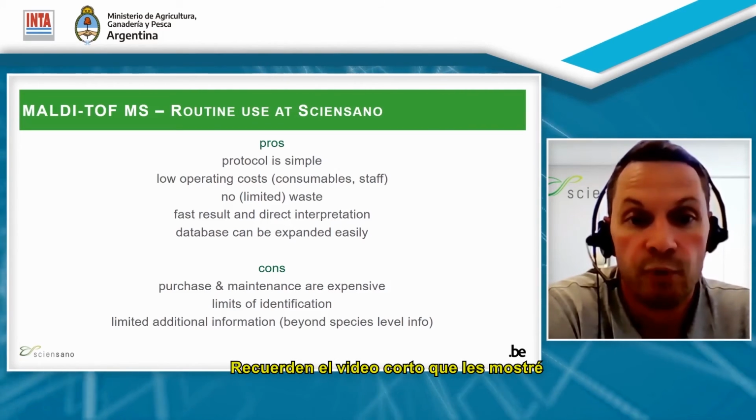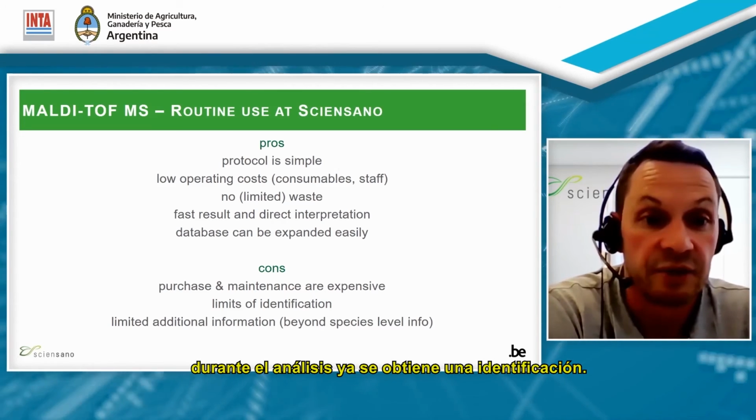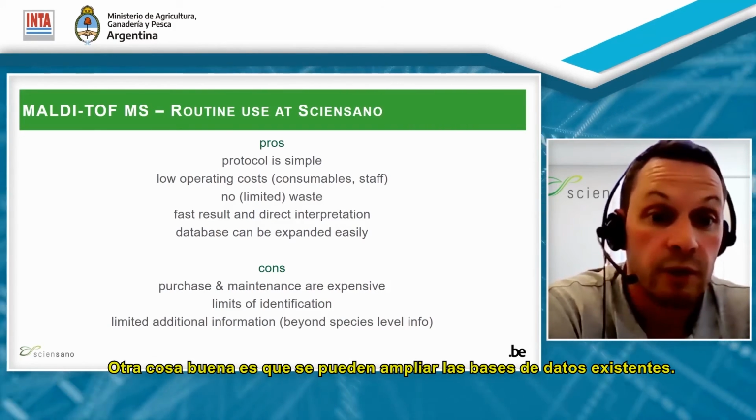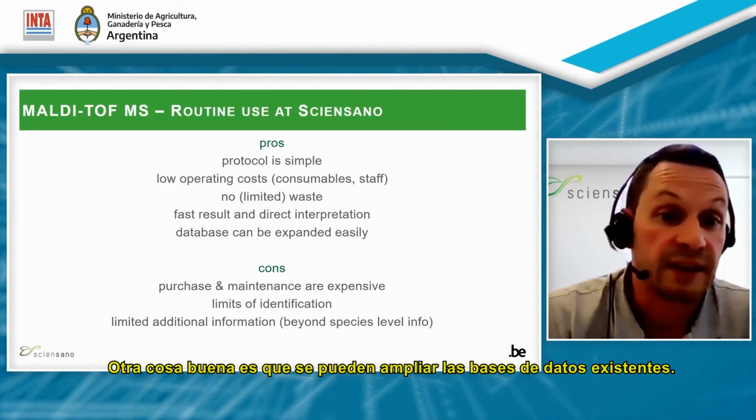Remember the short movie that I showed you? During the analysis, you already get identification. Also, a good thing is that the existing databases can be expanded.